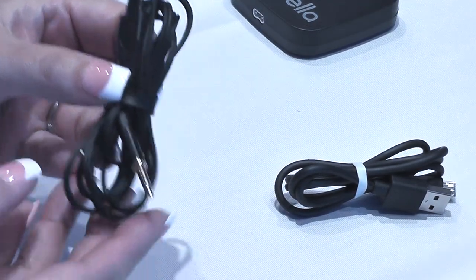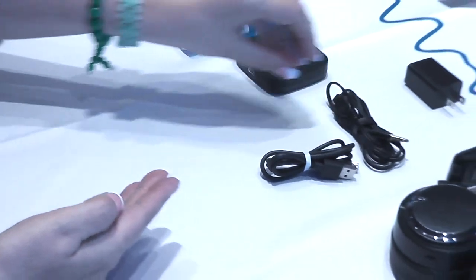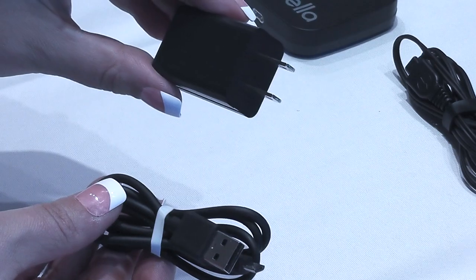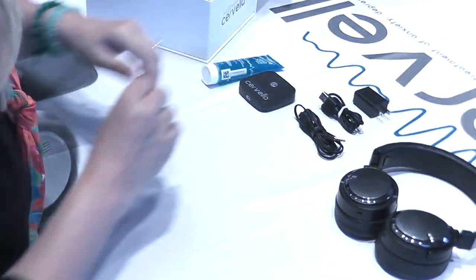This is the connecting cable that transfers the electric current from the Cervella main device to the headset. This is the charger and the charging cable. Use only this charger to charge your Cervella main device and headset.